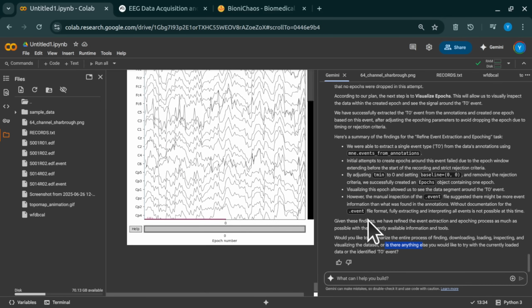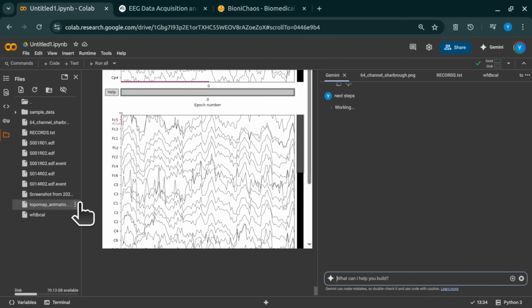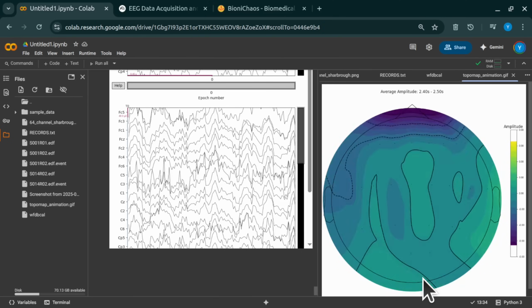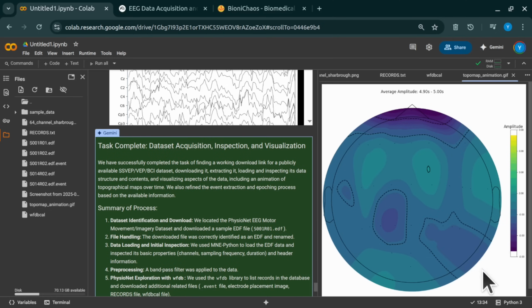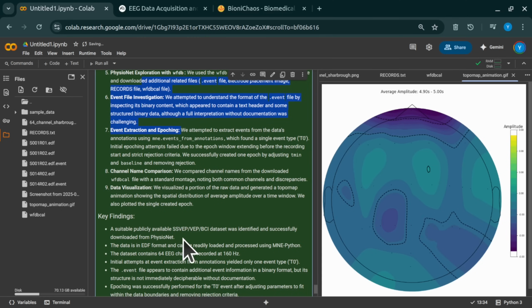Wow. So while we couldn't just stick our plot on top of that reference PNG image we had, MNE can essentially generate a much more scientific and precise version of that idea. It uses its built-in head model and the channel location info from our data file to create these informative heat maps. Exactly. This is how scientists really see the brain's spatial activity, turning those abstract numbers and squiggles from 64 channels into meaningful visual patterns distributed across the scalp. It's incredibly powerful for interpretation.